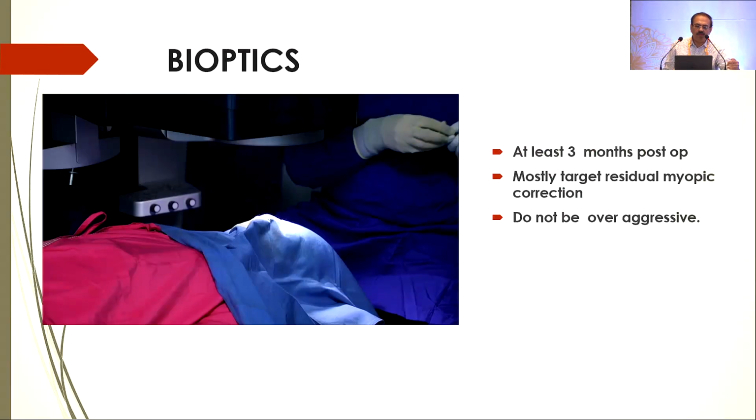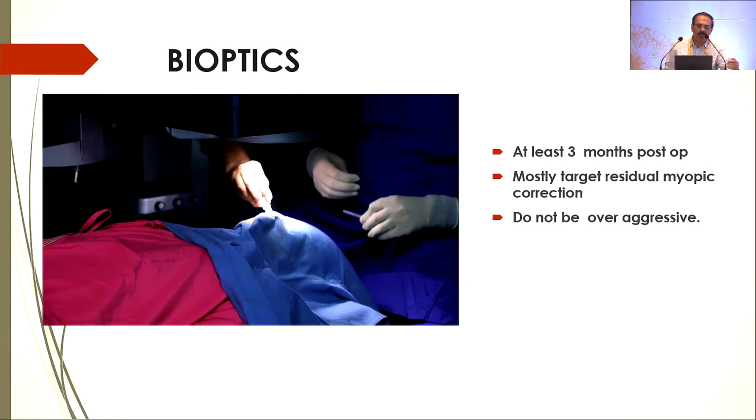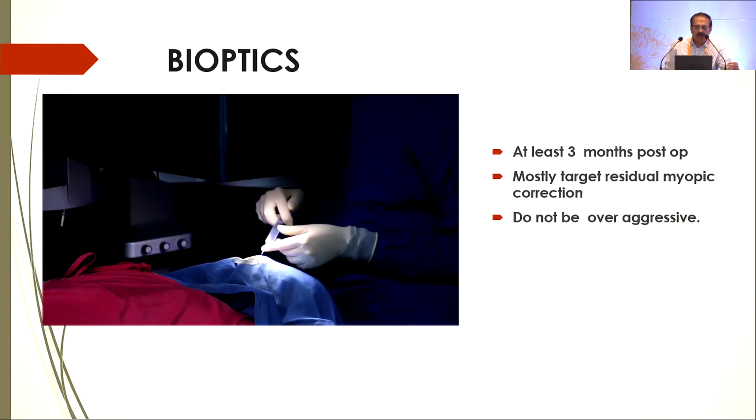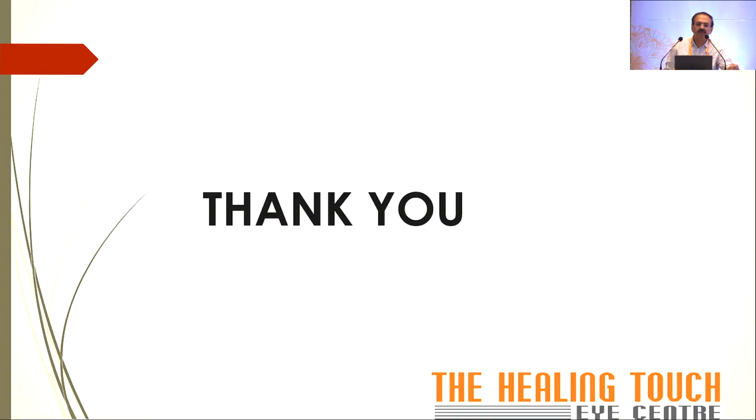And yes, if you are still left with some biometric surprises or larger residual powers, then of course bioptics is at your rescue, where you can treat the cornea with your excimer laser. Thank you.